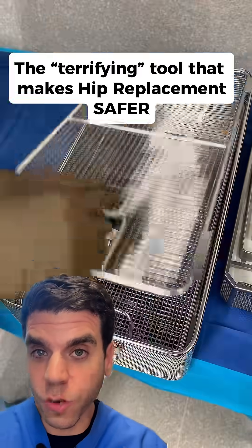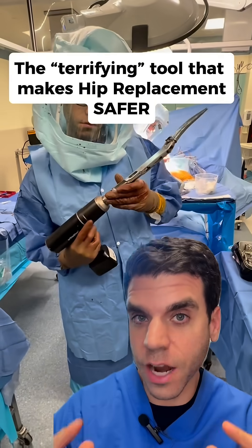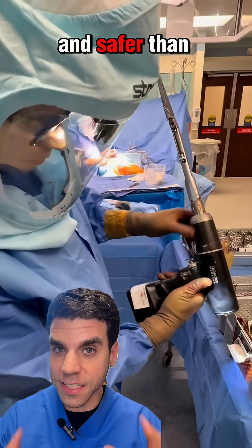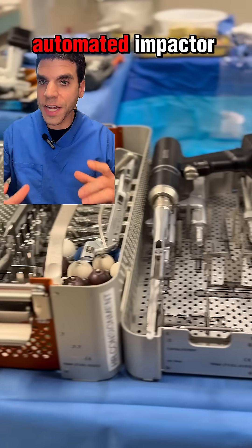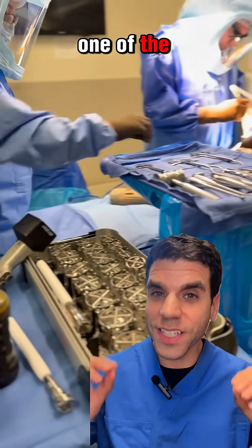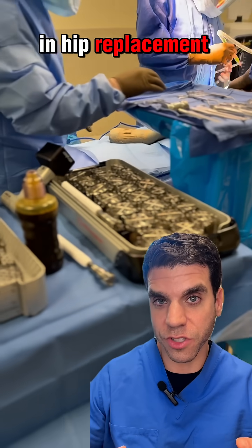The first time my OR scrub tech saw this instrument, she called it terrifying. But I think it actually makes surgery less scary and safer than ever. It's called an automated impactor. It kind of looks like a mini jackhammer when you first see it, but it's actually one of the safest tools we have in hip replacement surgery.